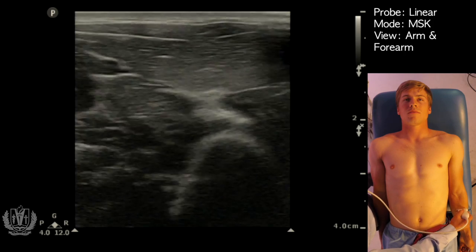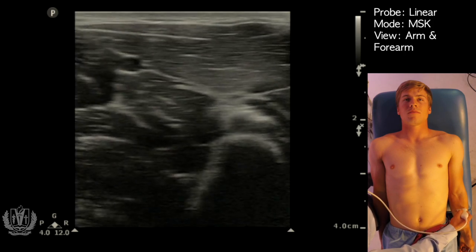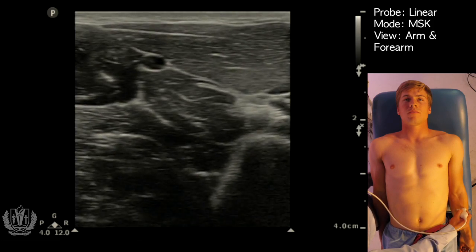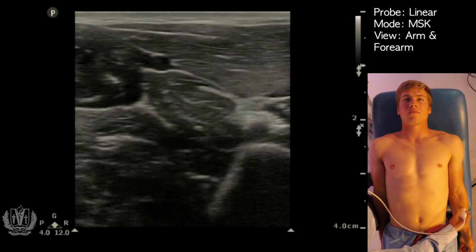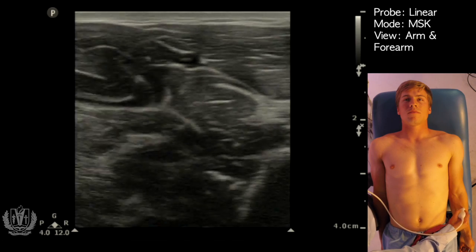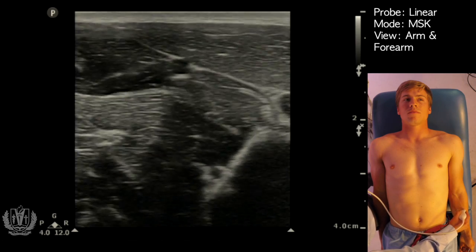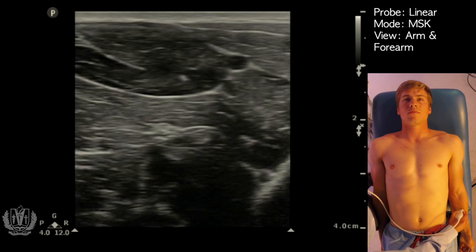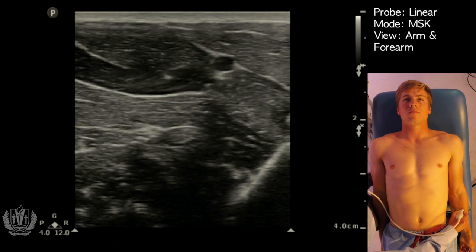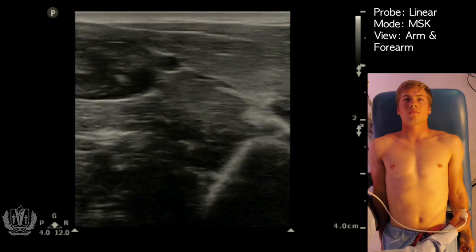So once again, with musculoskeletal ultrasound you can see the dermis and epidermis, you can see muscle layers, you can see nerves, as well as bones.